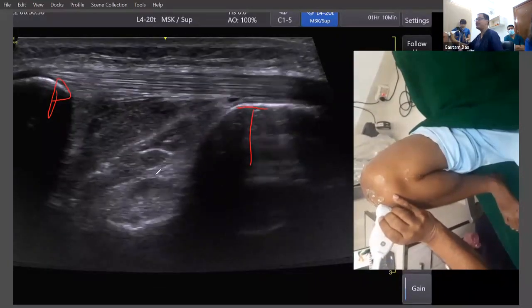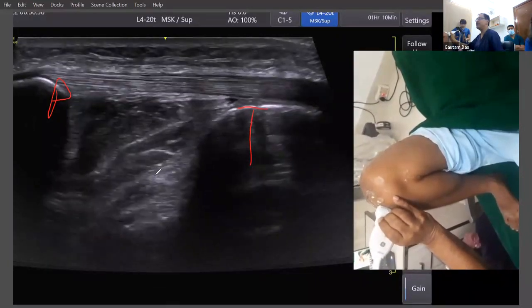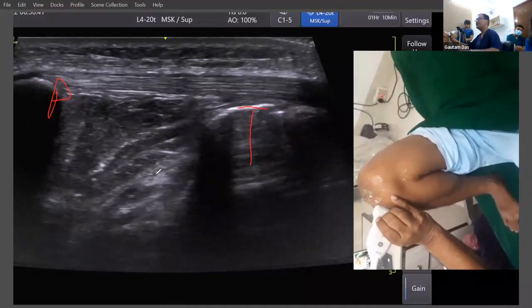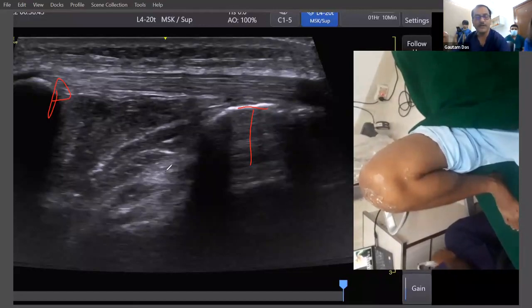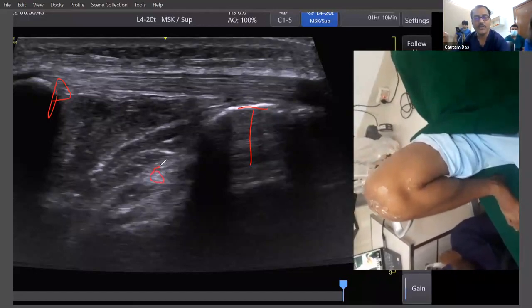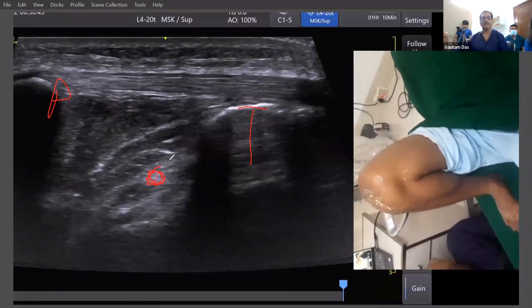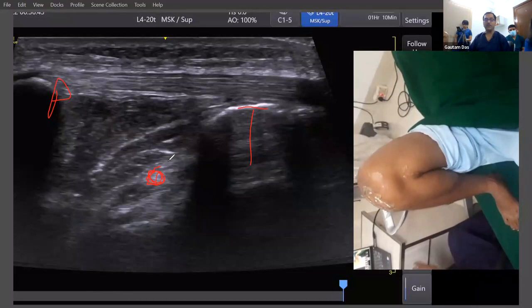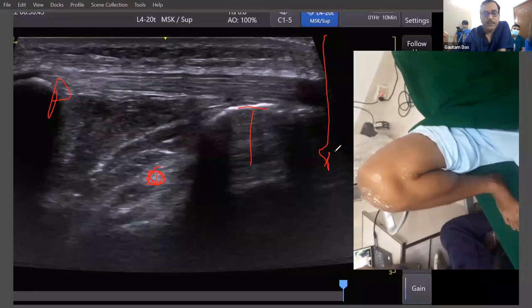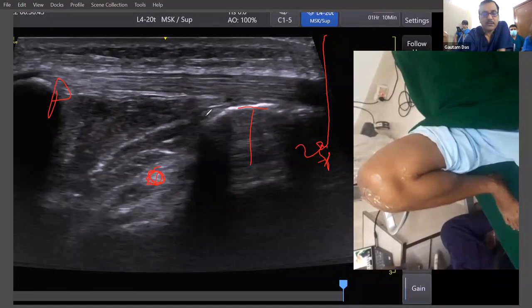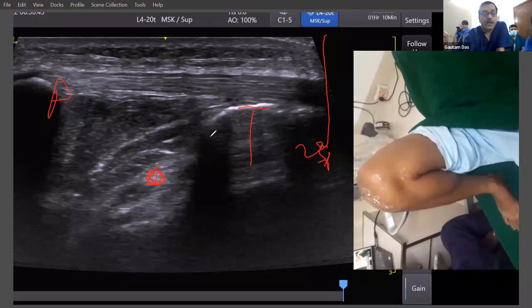This is not the ACL. Try to find a very hyperechoic cross-sectional area. This is the cross-section of your transverse ligament. Another important thing to remember is the depth — normally it is around two centimeters from the skin. Here it is only one centimeter below, so that is not right. Normally the ACL originates in the tibia at around two centimeters depth, and you have to find the transverse ligament first.